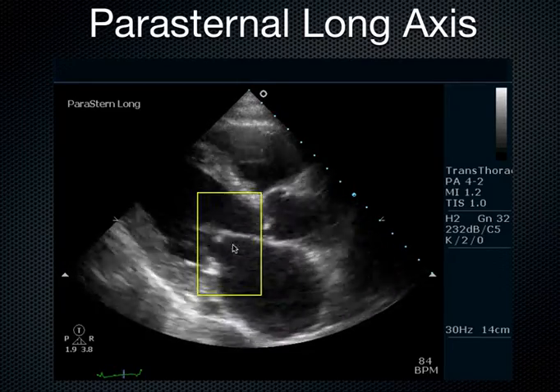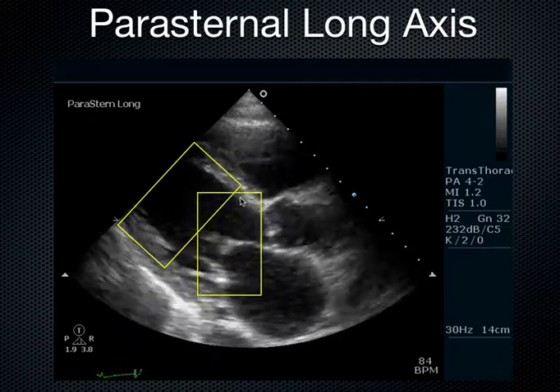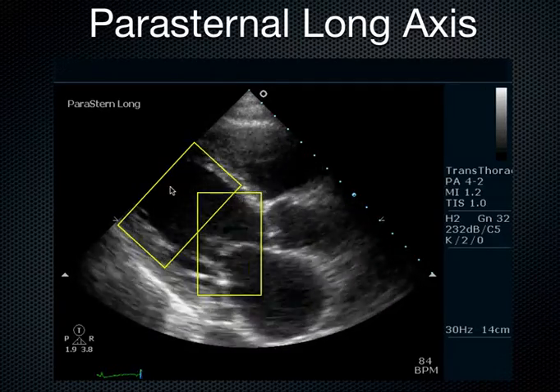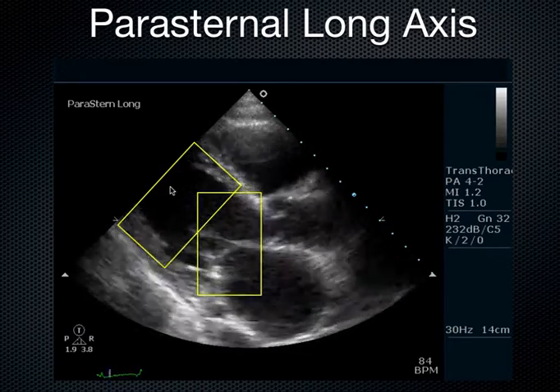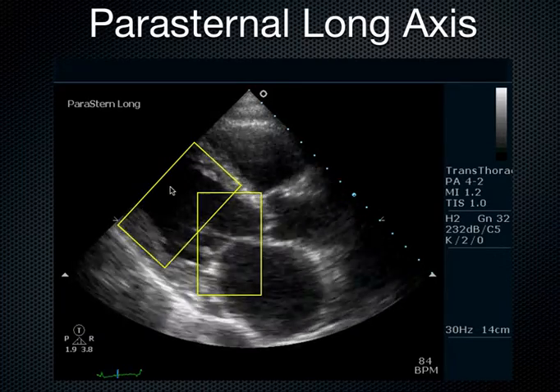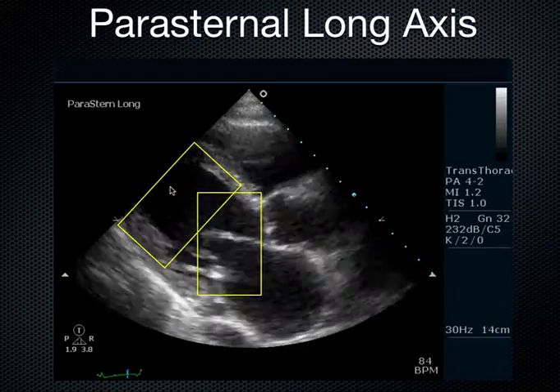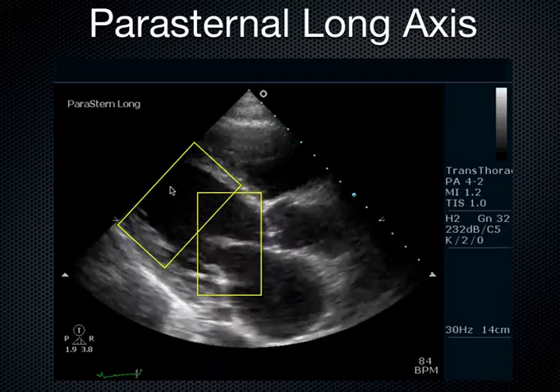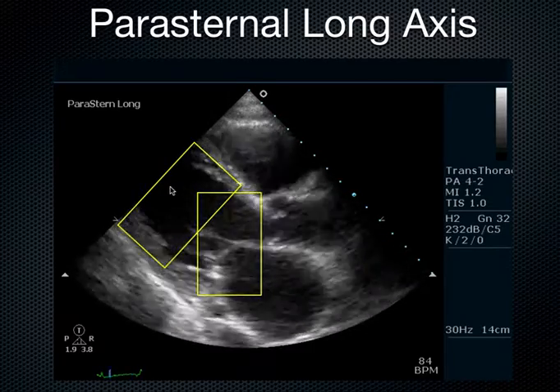Take, for example, this heart. Is the mitral valve coming up and smacking that septum? Nope. What about back here? Do we see a lot of good squeeze here? A lot of delta or change in the chamber size between end systole and end diastole? Nope. So this here is a patient that, if the nurse comes to me and says, Dr. Fox, the guy in bed 5, his blood pressure is 70. Is it okay if I give him a liter bolus of fluid? And you're tempted to say, sure, go ahead and do that. Let me know what the blood pressure shows when you're done.